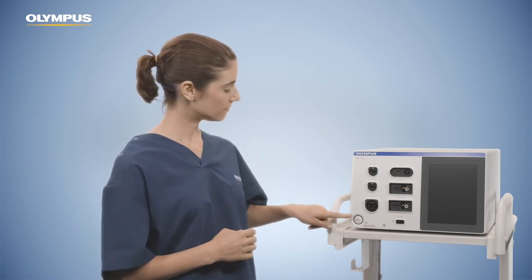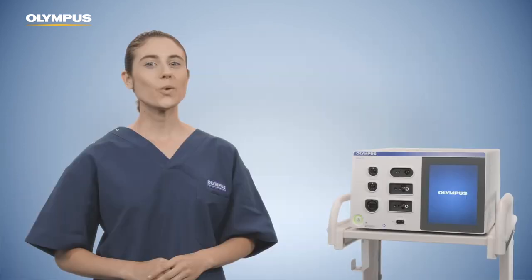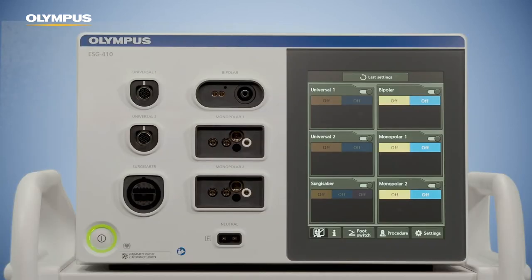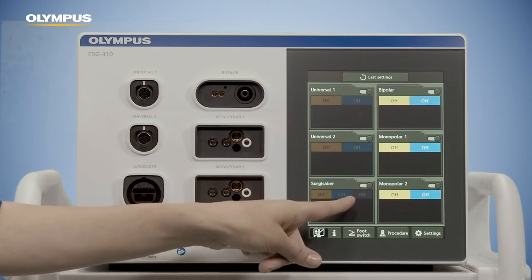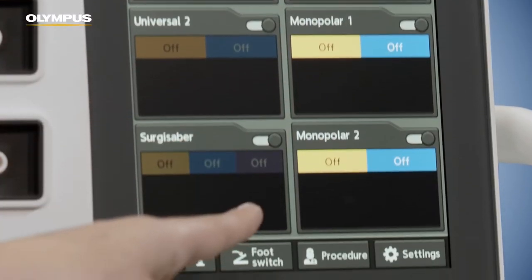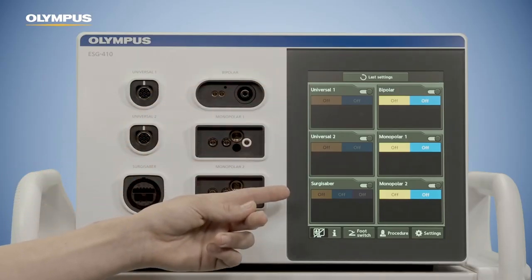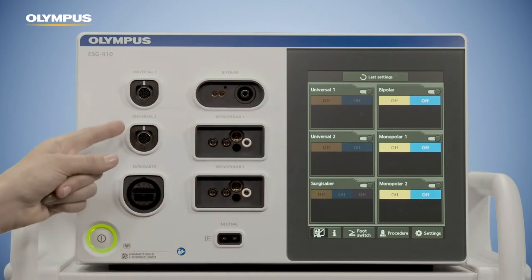To start up the generator, press the power button. When you switch on the generator, a graphical user interface lights up. The graphical user interface provides three different display layers. The first layer is the home screen, which shows all connector settings and allows you to change them. The home screen is divided up into six panes, which correspond to the six sockets in the connection area.